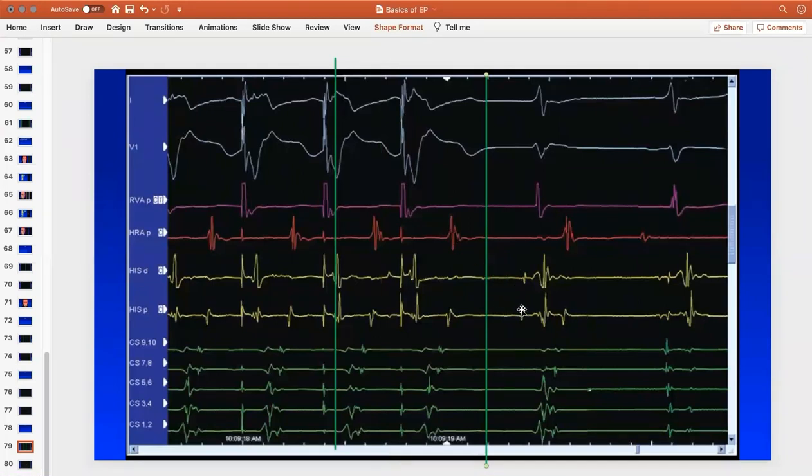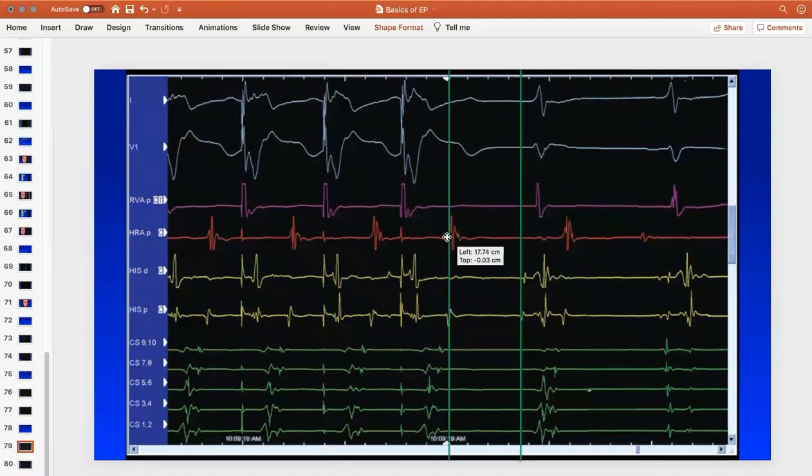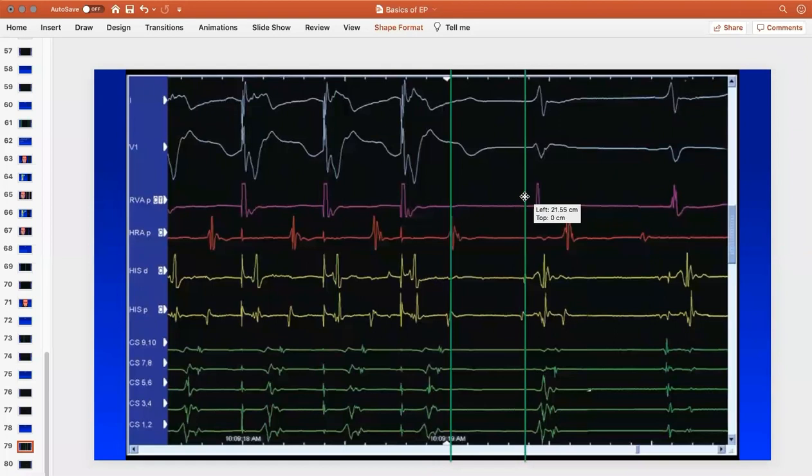with a very long HV. Long, okay. HV, not AH. That you went through what? Yes, this went through, again, through the coronary sinus, and then back again to the atrium. Looks like an echo like this. Yes, exactly. So the AA, it repeats itself. Yes.